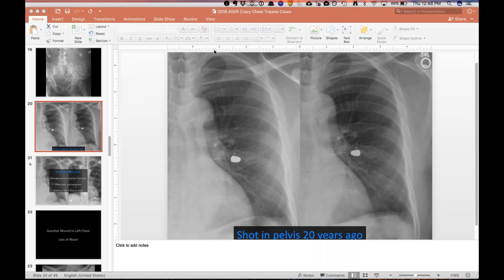I'm going to show one of my old talks on bullet embolization. This was a case I saw at the VA a couple of years ago. Whenever there's a bullet, just like in David's case, I always tell the resident: don't assume the patient was shot in the chest, especially if they don't have any other signs of being shot. This patient was a vet who'd been shot a while ago. These images are at different time points a few years apart — notice the orientation of the bullet has flipped in the pulmonary artery. He was asymptomatic, they didn't do anything about this. It's in the left pulmonary artery and just had rotated. As opposed to David's case where it got lodged and caused ischemia, this is just kind of floating in the pulmonary artery.